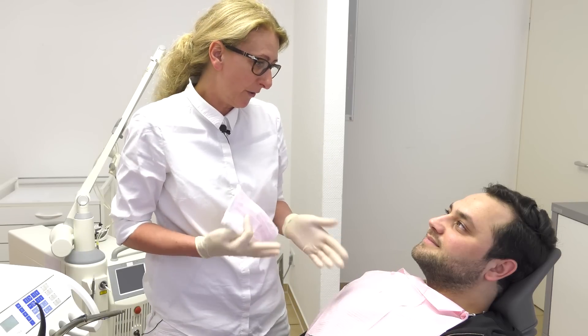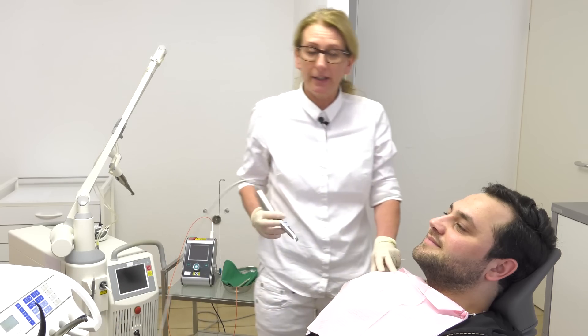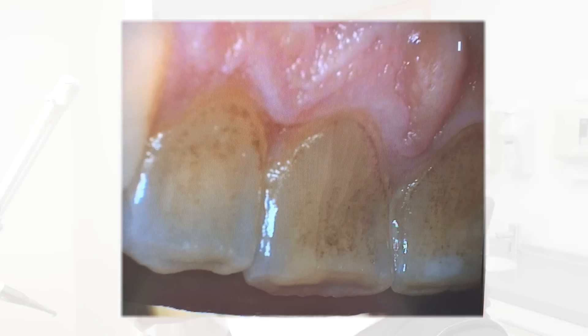We will use the conventional ultrasound dental scaler in combination with the Erbium YAG laser. In step number two, we will polish the tooth surface, and in the last and third step, we will take off the hypersensitivity of the tooth neck. Before I start, of course, we will take a picture so you can see the tooth before. As you can see in the picture, the tooth surface shows discoloration and tartar, and the aim of our treatment is to have a bright and healthy surface.